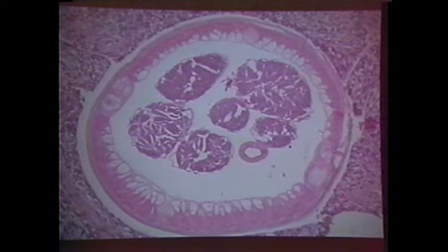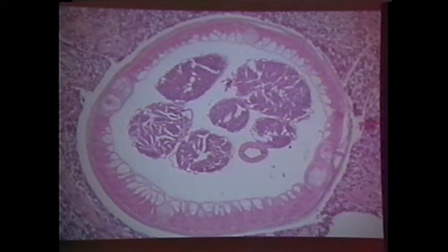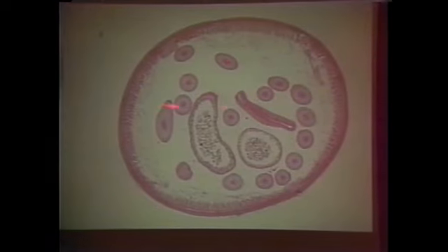Anytime you see more than 1 genital tube, you're probably dealing with a female. I'll repeat that because I have stepped all over these wires. If there's more than 1 genital tube, it is a female. If there's 1, it's a male. You want to tell your contributor you have an adult female. It makes you look good. This is a female, that's a female.